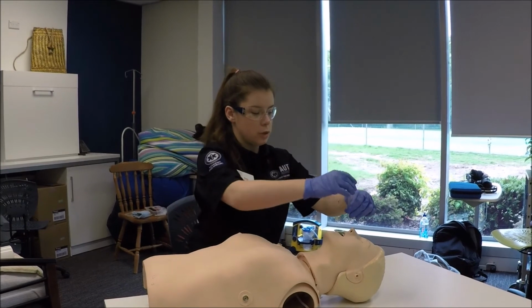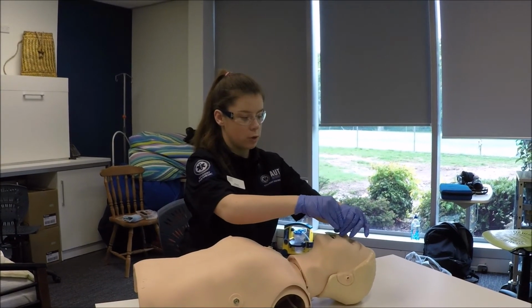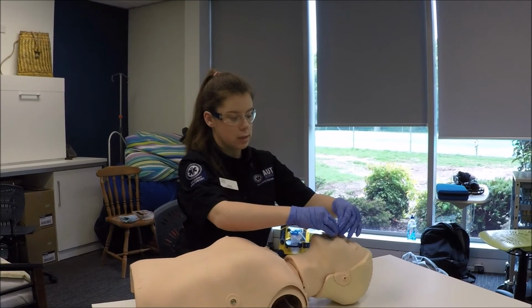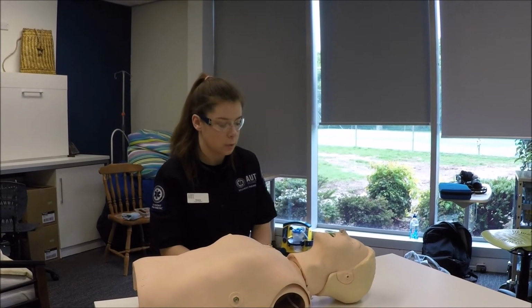So to insert, we choose the biggest nostril, and if we meet any resistance as we insert it, we can overcome this by rotating the NPA, or if there's too much resistance, we can try the other nostril. And again, just checking that the patient has tolerated the airway after we've inserted it.